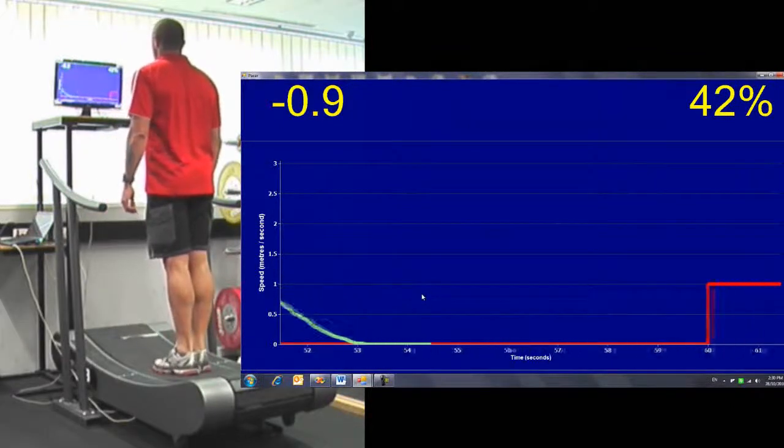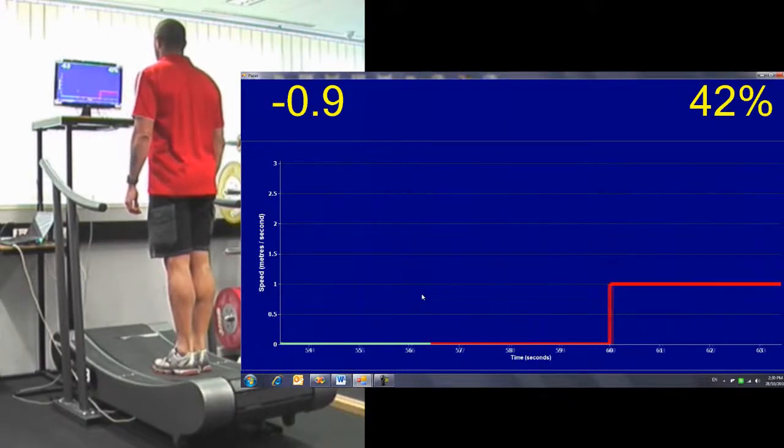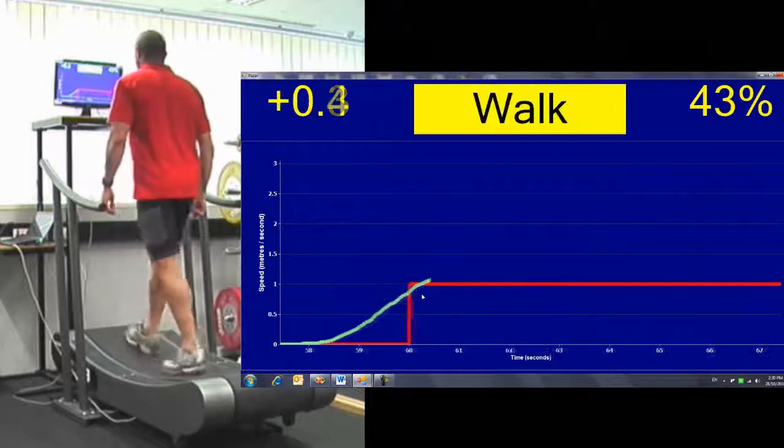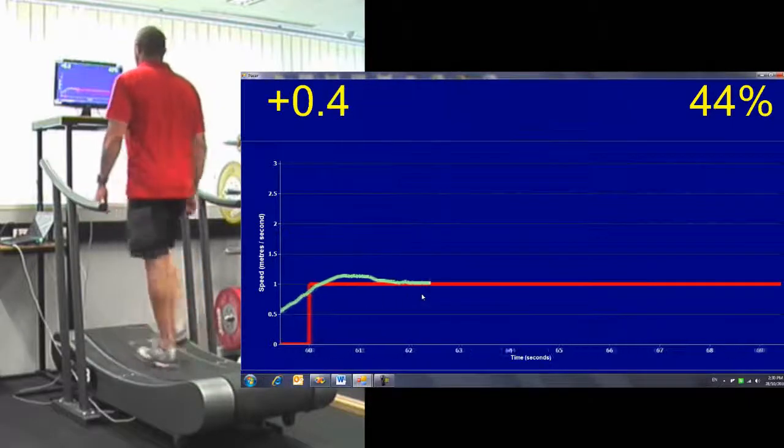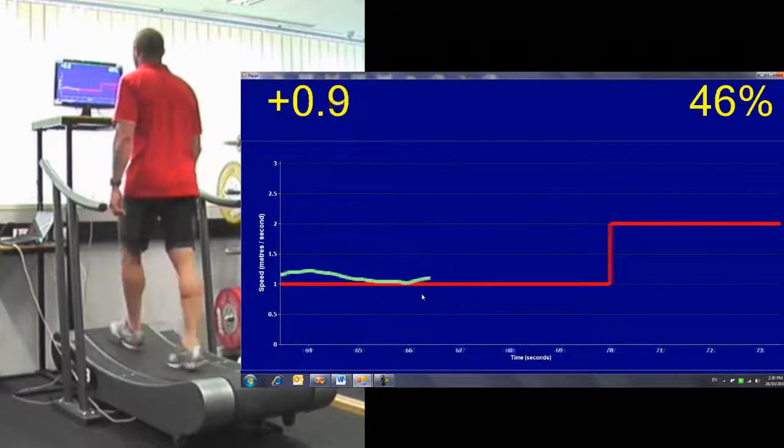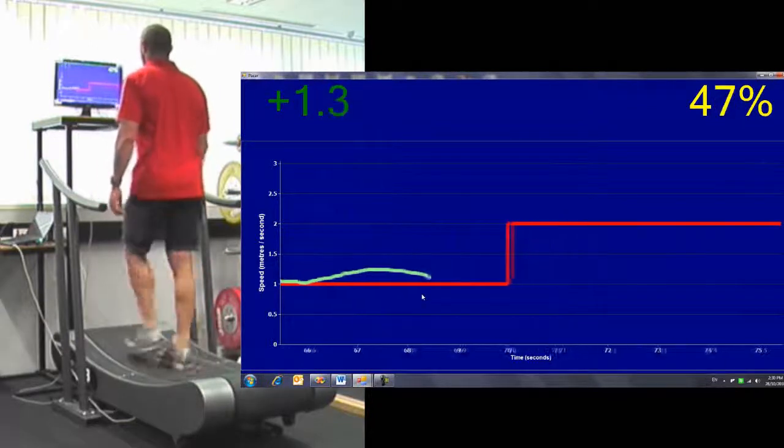As you are behind the target, the numbers on the upper left are red. As you get within a meter of the target they go to yellow. When you are over a meter ahead of the target.